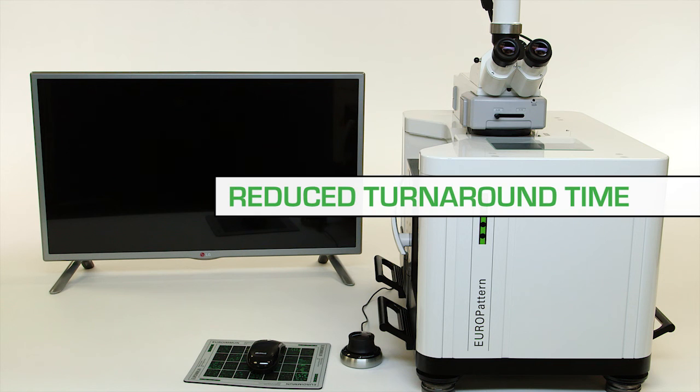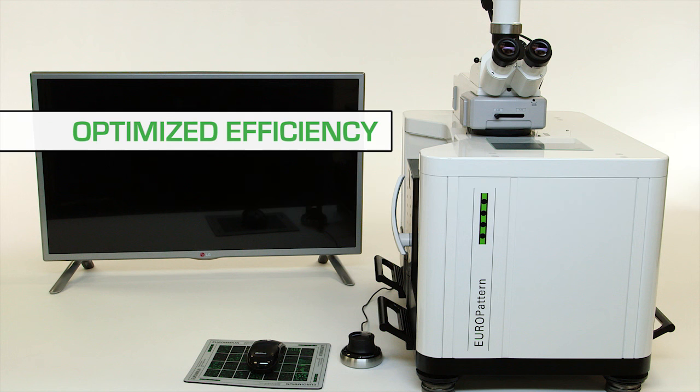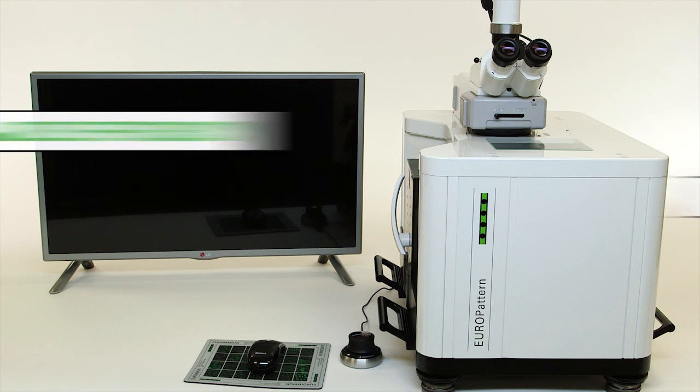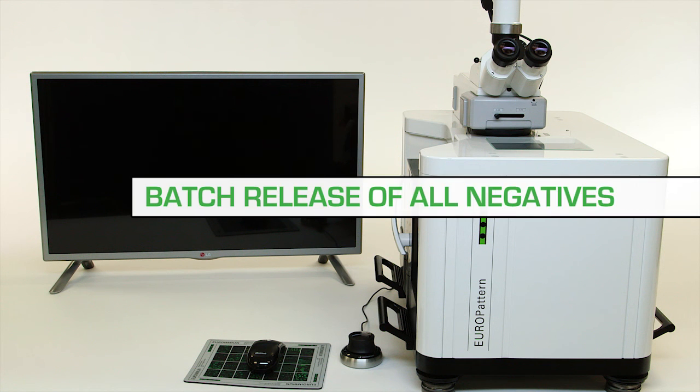Turnaround time is dramatically reduced and workflow is optimized through the efficiency of the Europattern system and the ability to batch release all negative results with the click of a mouse.